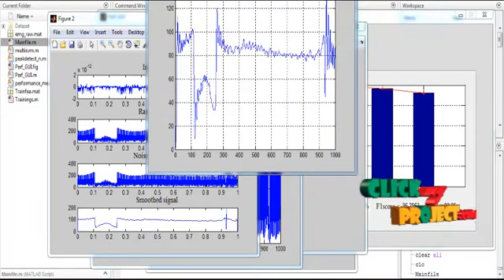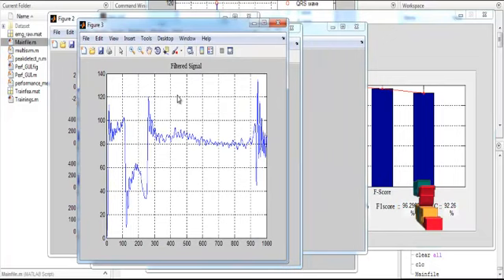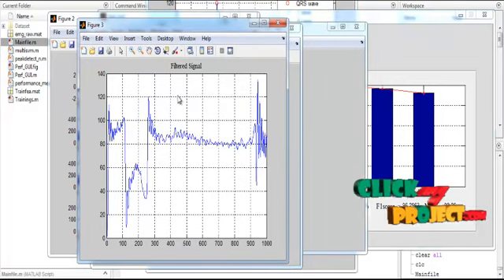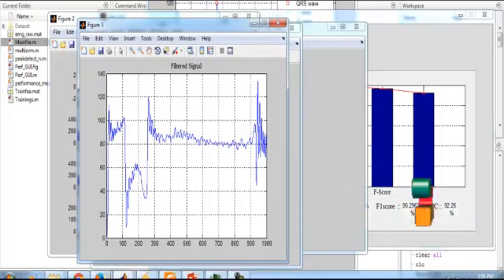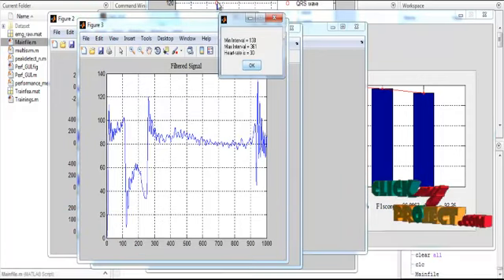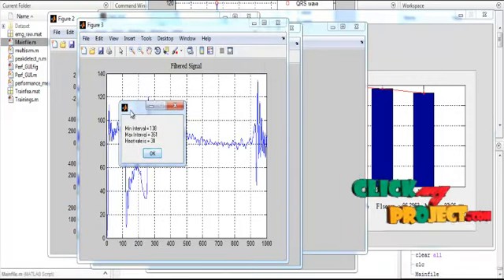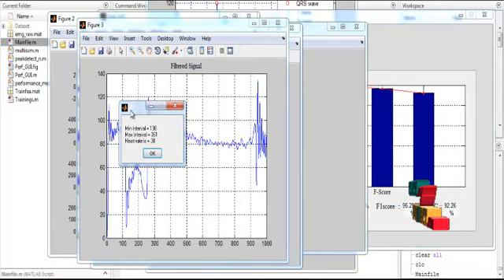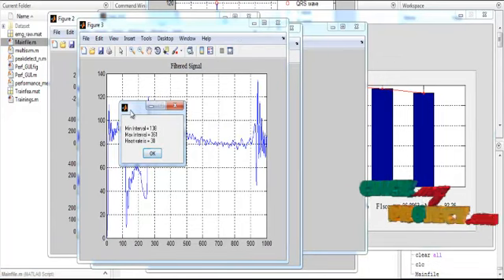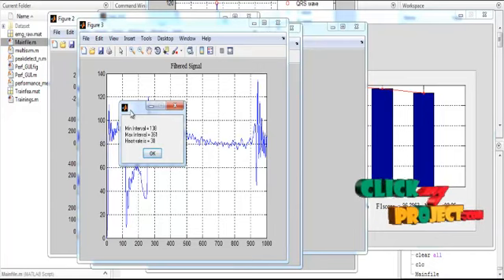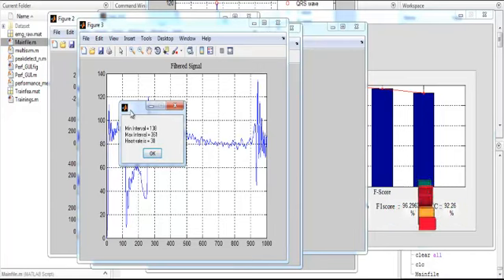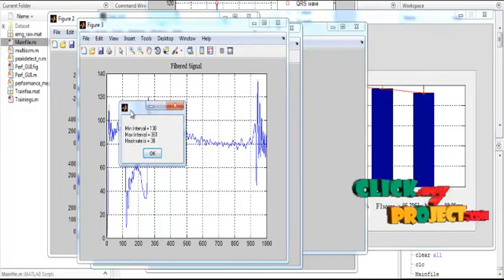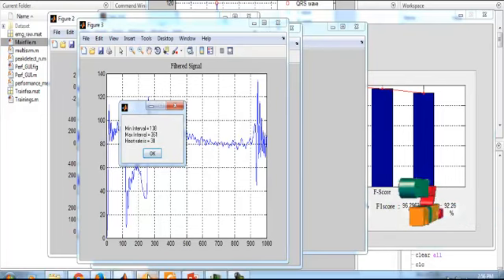Figure 3 represents the signal filtered with a second filtering method, showing the filtered signal with the title 'Filtered Signal'. After the pre-processing is completed, parameters are estimated: the minimum interval is 138, the maximum interval is 361, and the heart rate is 30.